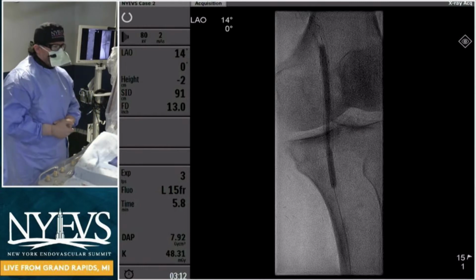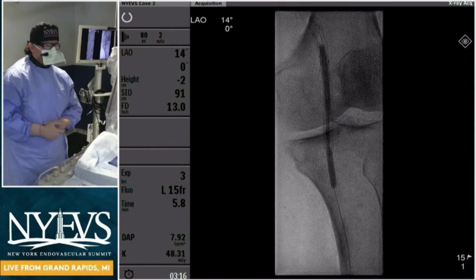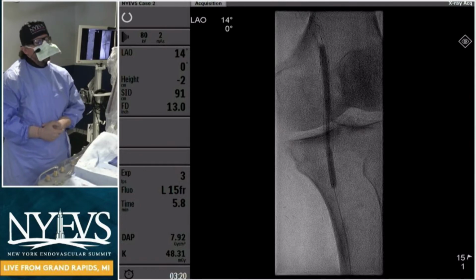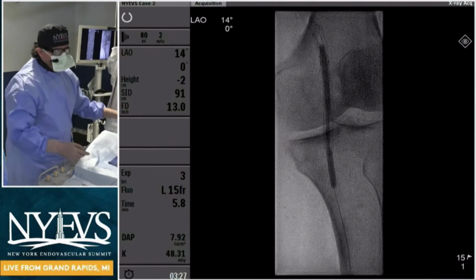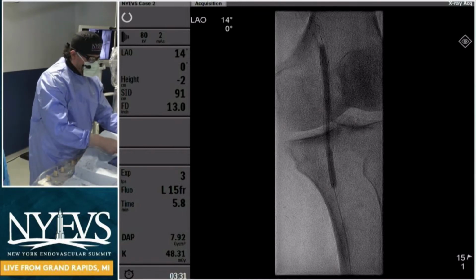Down, please. So I am down from inflation there. I'm going to take a picture to show you what we're going to do. Typically, I would actually treat the PT before, but I want to make sure that we're respectful of the time. So I don't know how much time we have. Oh, you've got plenty of time. I want to show you the final results. Yeah, no, you've got plenty of time. I just want to ask the panel.